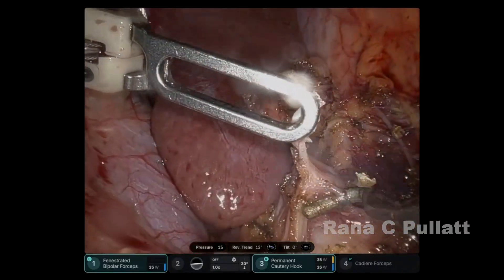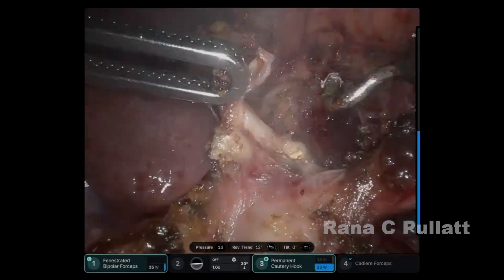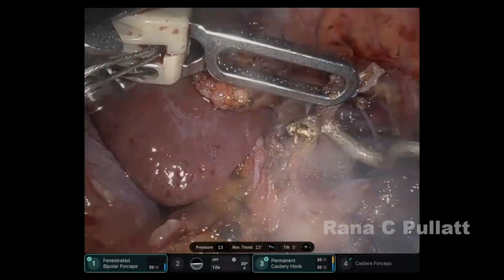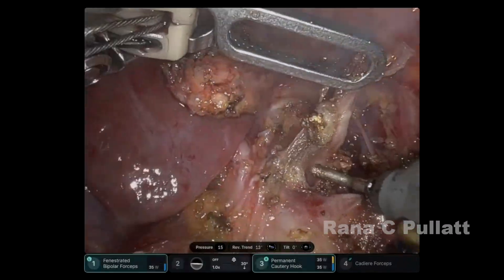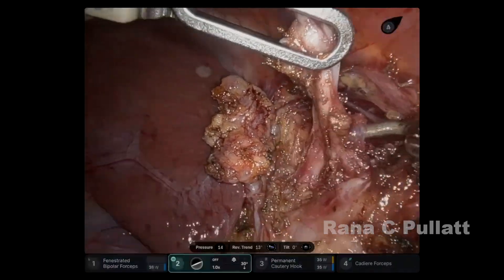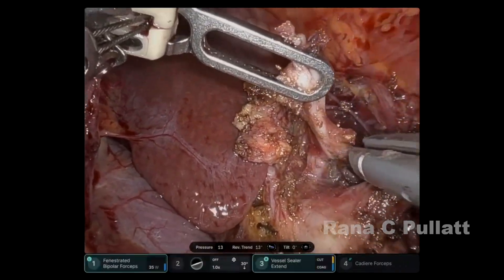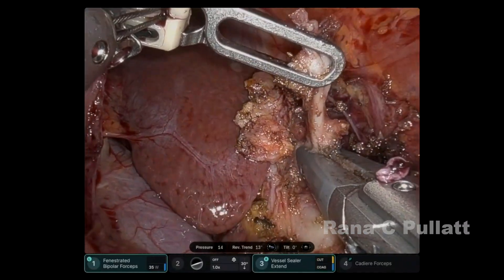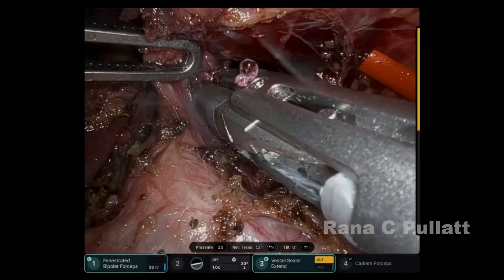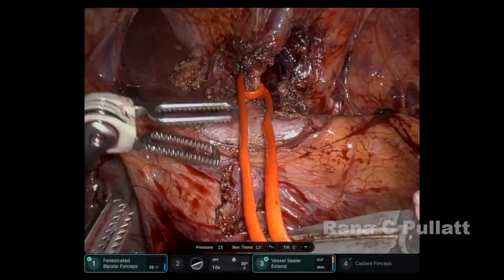The celiac fibers are then dissected to get them unraveled from around the celiac artery. Once all of this is released, the celiac ganglion is excised and sent off for pathological analysis to confirm inflammation and that the celiac ganglion had been removed.